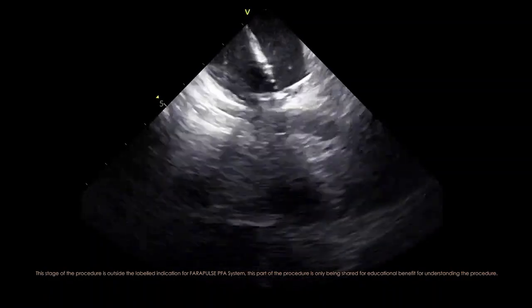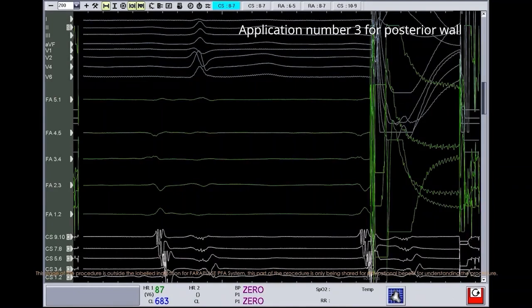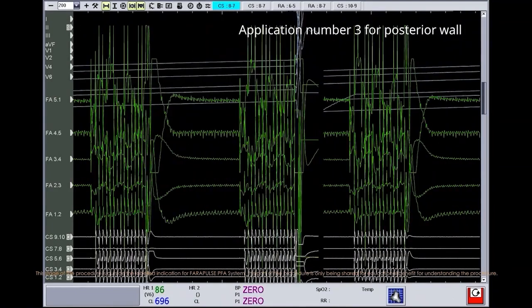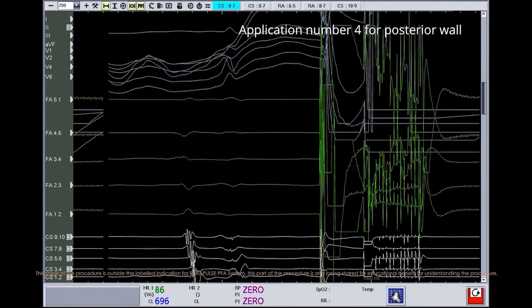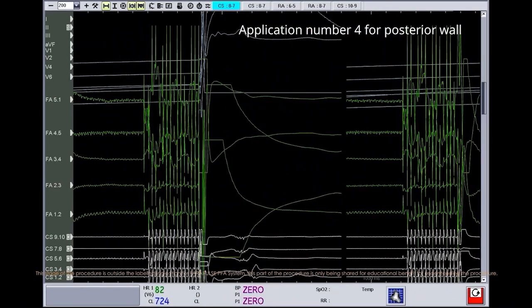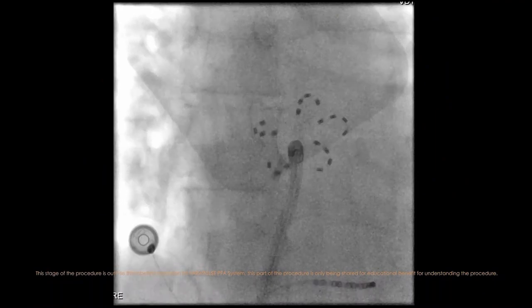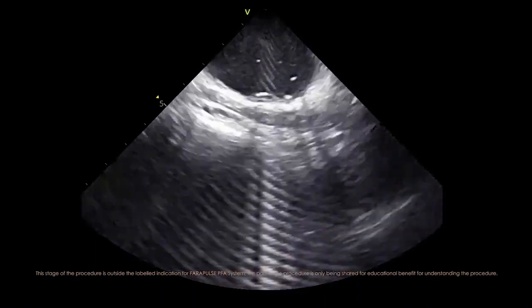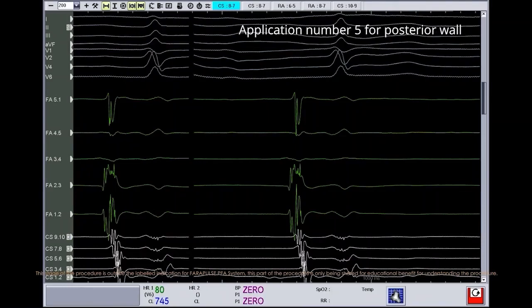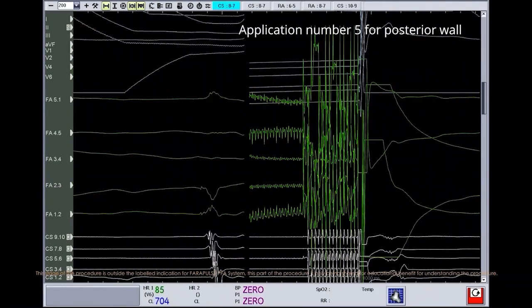Contact is confirmed by ICE. We believe that this might be crucial because after few pulsed field energy deliveries, there are usually no detectable electrograms to verify good contact with the tissue. We aim to have about 50% overlap of each position with the previous one. At each side, 2 applications are delivered.